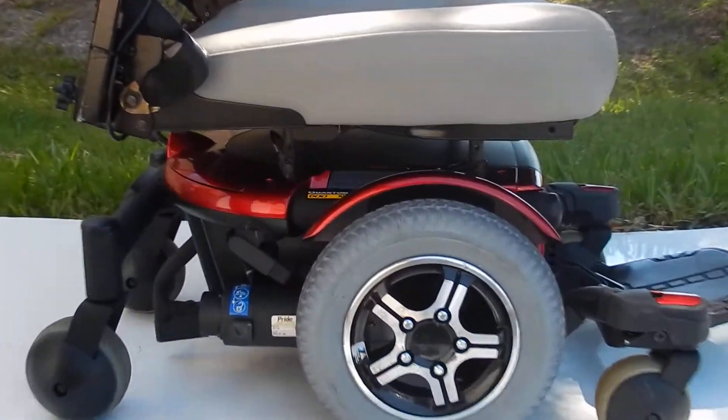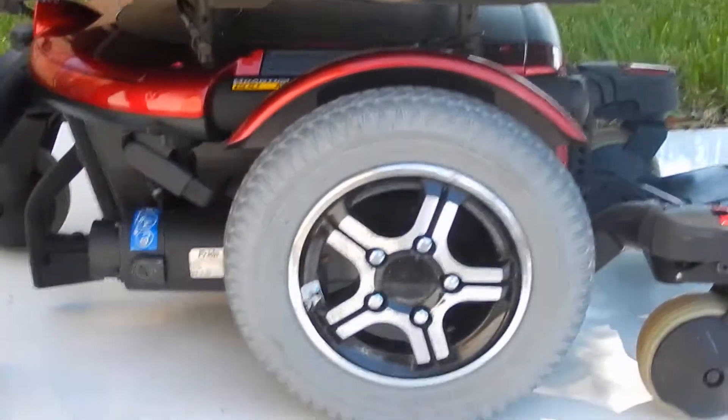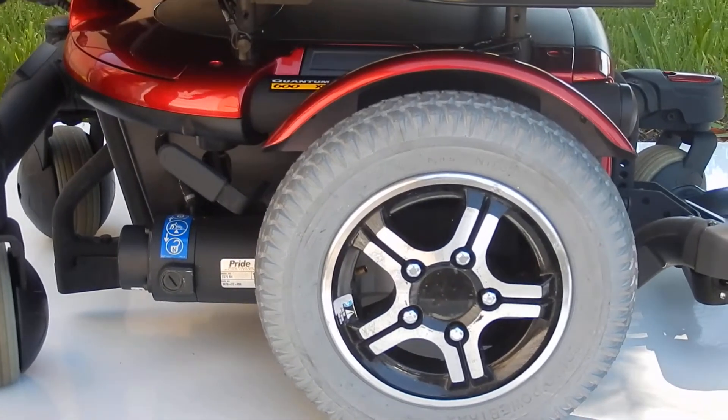The Quantum brand is a little bit better quality, better motors. There's two motors, one on each side. These motors have levers to put the motors in neutral. You push it down, the wheel becomes neutral. There's one on each side.